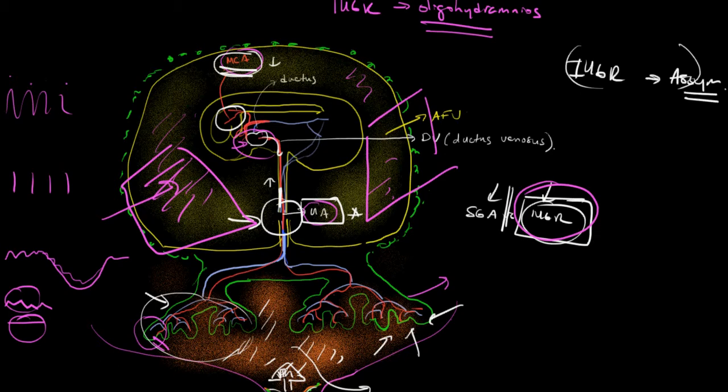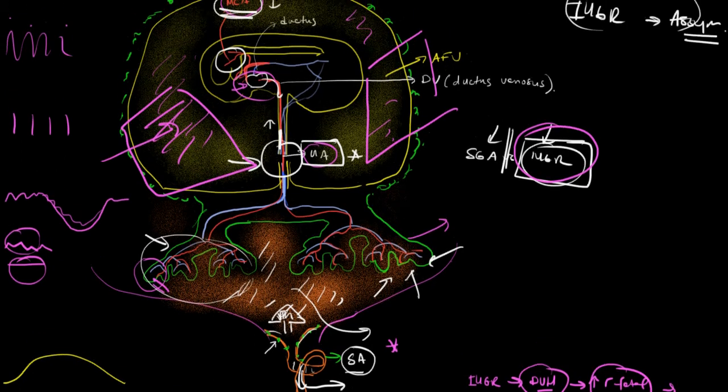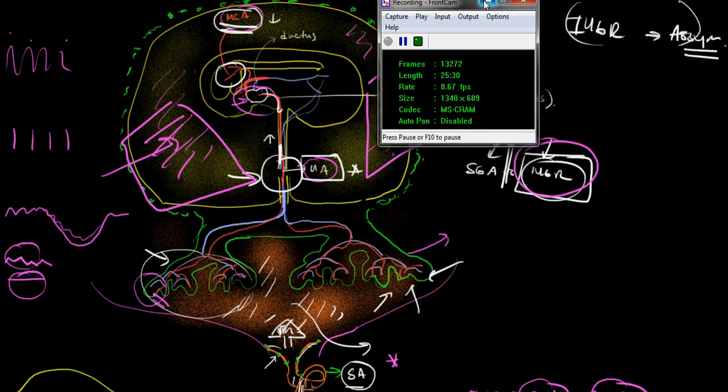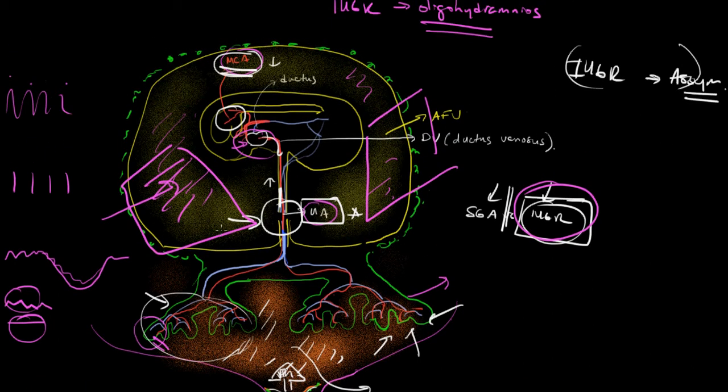Especially in the context, so the question is, if the uterus contracts and that deprives the placenta of blood, and the baby starts to show decrease in heart rate or bradycardia, that suggests that the baby is hypoxic. And the uterus contracting is sort of like a stress to the baby, and it's sort of like what we do with adults when we put them on an exercise treadmill test.